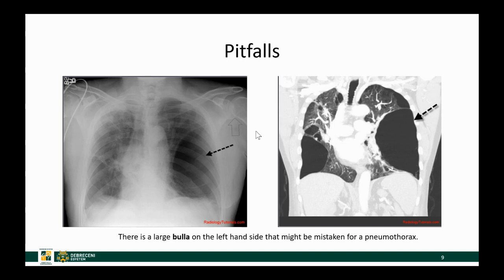Emphysema might also be problematic because if patients have large bullae, we will see a white line and beyond that white line we won't see normal lung markings. However, these white lines are not convex towards the lateral side of the chest — they are more convex towards the middle of the patient. So this is not a pneumothorax. This was caused by a large bulla, and the chest CT shows numerous other bullae within the lung.